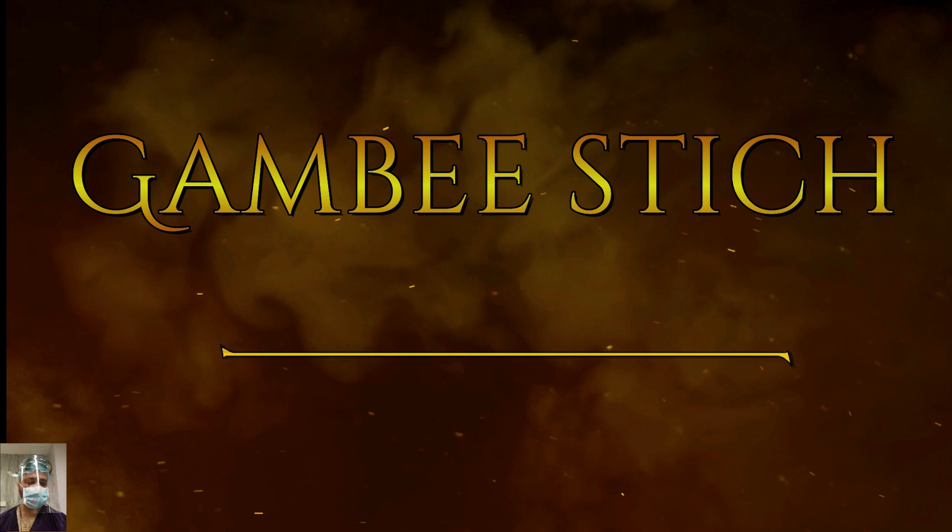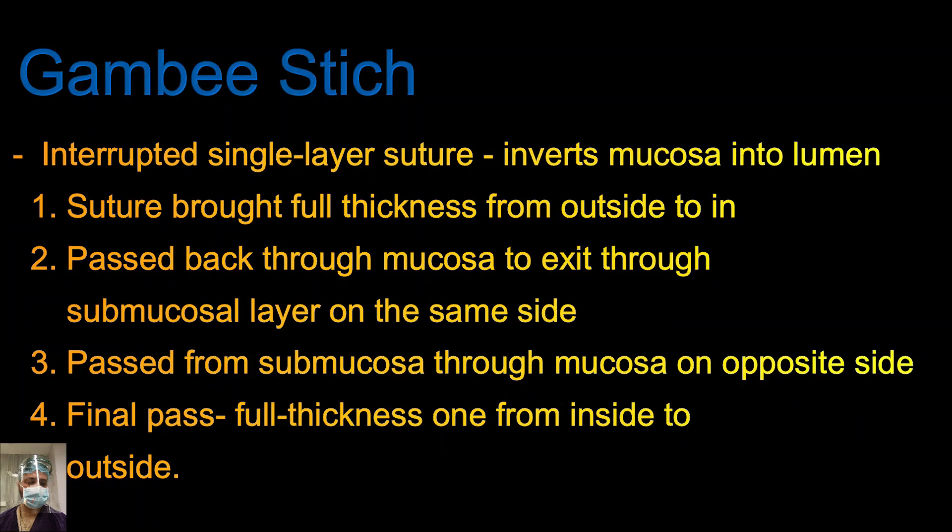The Gambee stitch is an interrupted single-layer suture which inverts the mucosa into the lumen. It is basically employed where you are having some difficulty dealing with scarred or fibrous tissue where the edges are friable. To add extra security, the Gambee stitch is a beautiful addition to your surgical armamentarium.